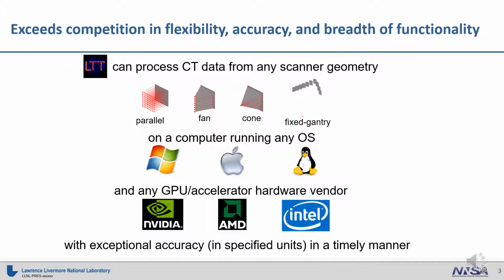So when we reconstruct something, we say this is your reconstruction in units of mass density, grams per centimeter cubed, something like that. What this does for you is you can go beyond qualitative to quantitative, like material characterization. You could say, this is iron at 90% theoretical maximum density. But to do that, it involves a lot of modeling and physics that you need to put into it.